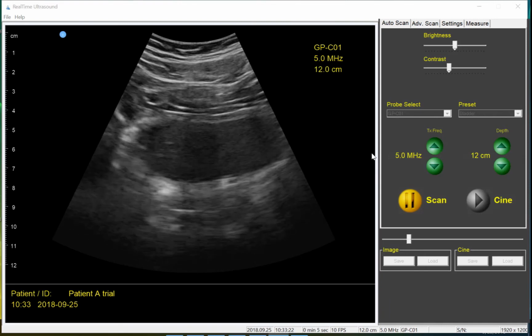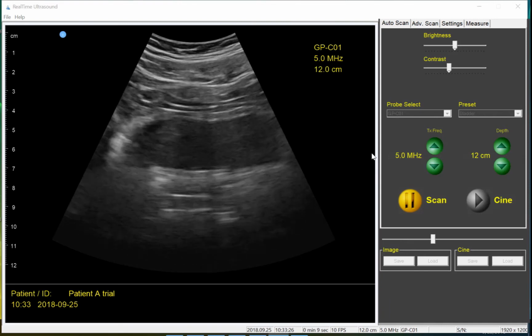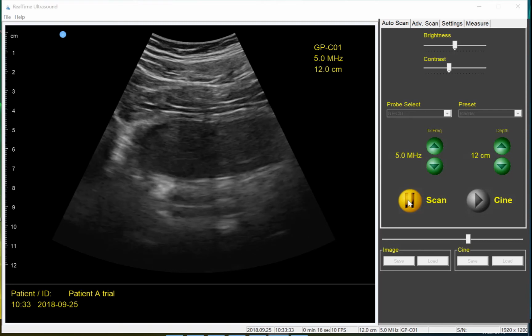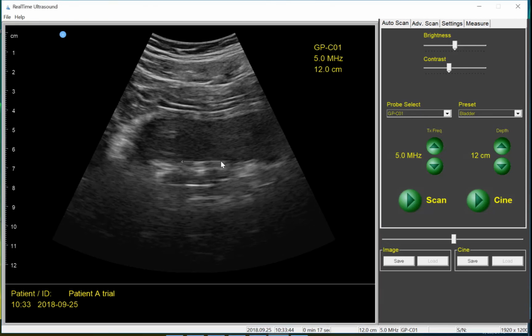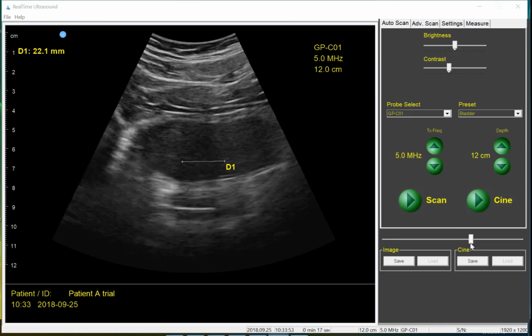I just asked my patient to do a couple of contractions and relaxations. I'm making sure I have a nice picture of the bladder base and/or the vaginal stripe. Stop her contraction. And then I'm going to scroll back and forth with the cine buffer. This time, same thing, bladder base. I started at the peak, go back down, find the valley, and I went too far.